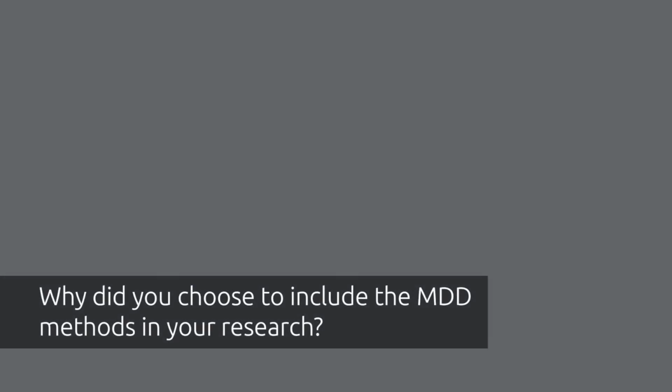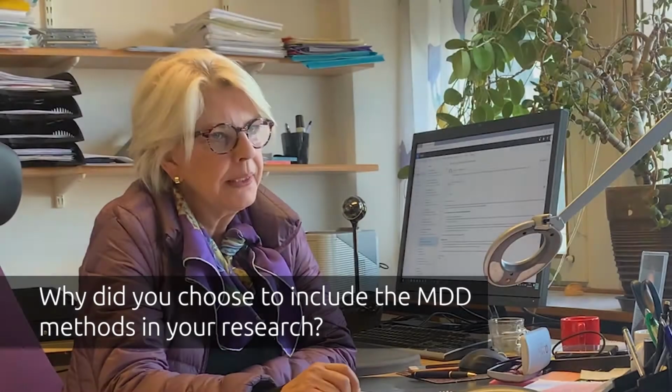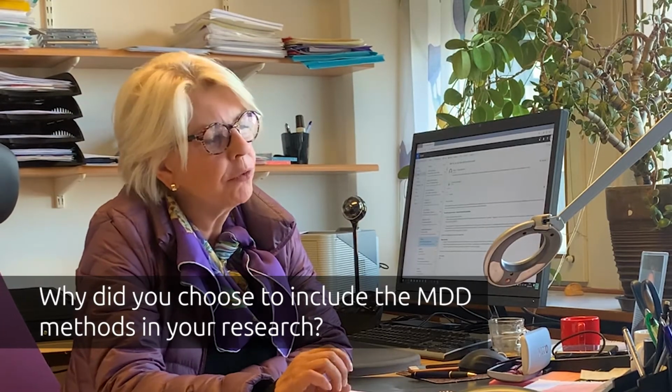Why did you choose to include the MDD method in your research? Well, I have been fortunate to work with you and with Marcus Nilsson, who has introduced part of this. We very early wanted to see if it was feasible, especially in brain tumors, as the possibility of looking into more microstructural changes in the brain tumor rather than just the conventional images.